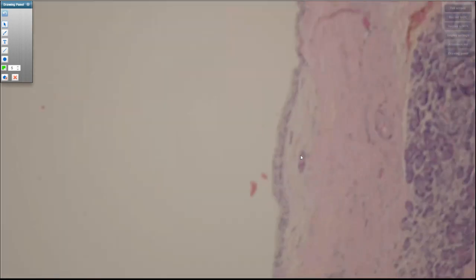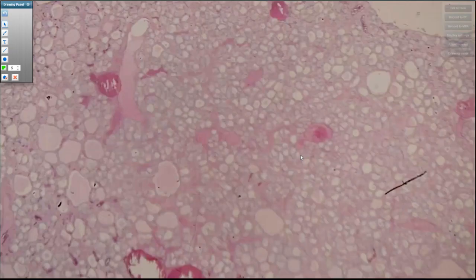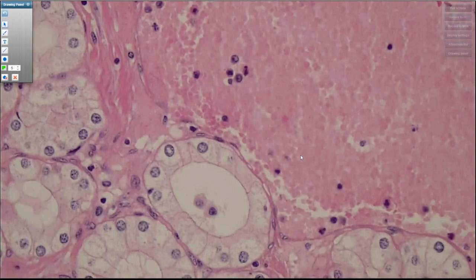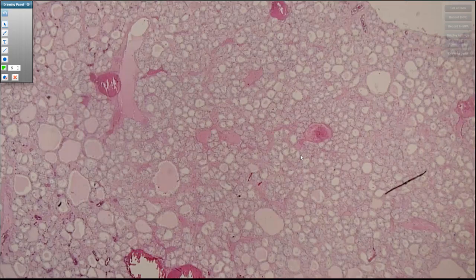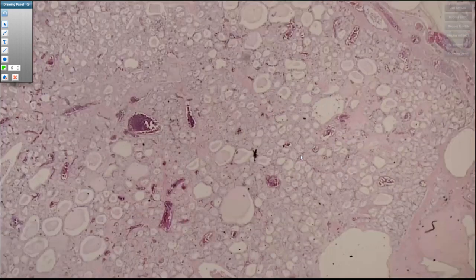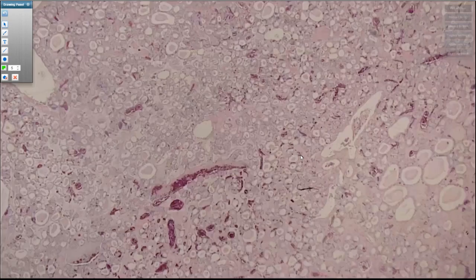It can also have a more solid appearance, which again is one of the things on imaging that can be a little tricky. I apologize, I'll have to do a lot of refocusing. Some of these are all consult slides and things of various thickness. So I'll refocus for a second so we can look at this one. But they can be more solid, which, as I mentioned on imaging, can make it a little more challenging to pick up that it is a serous cystadenoma, and it can overlap with features of other solid neoplasms like a neuroendocrine tumor, etc.